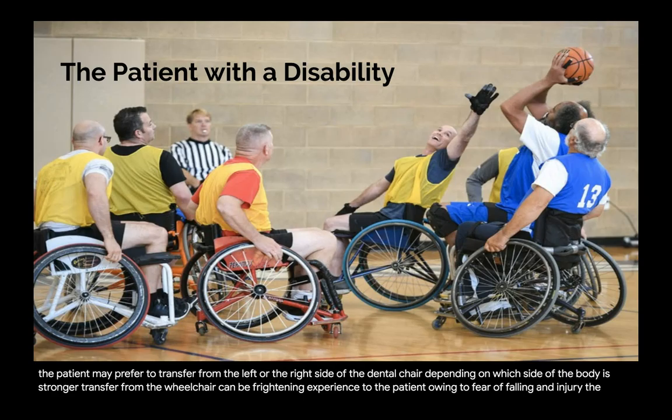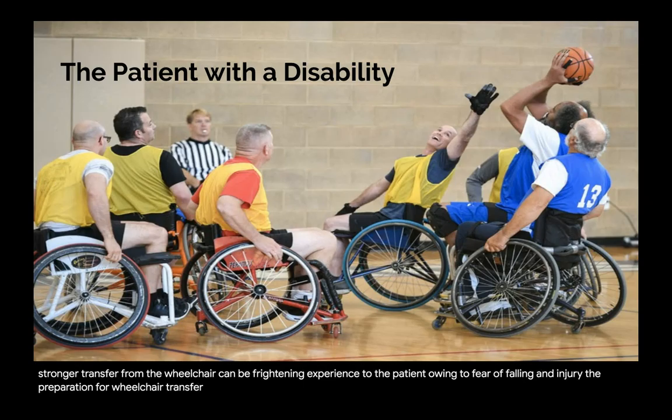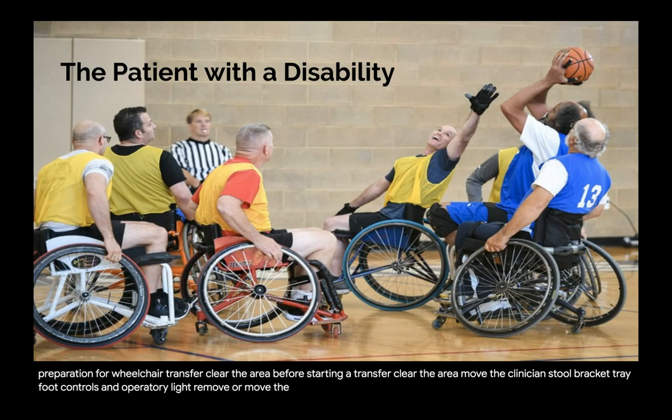The preparation for wheelchair transfer. Clear the area. Before starting a transfer, clear the area. Move the clinician's stool, bracket tray, foot controls, and operatory light. Remove or move the operatory chair armrest out of the transfer area.